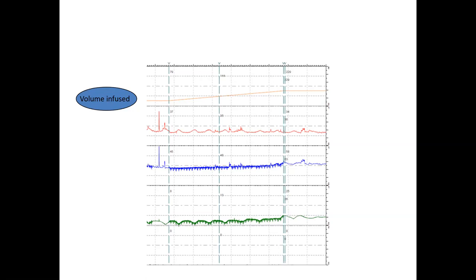If you were monitoring changes in your resting pressure here, you would also notice that you'd had a steady rise on your vesicle line as you fill. So that was a really interesting question earlier about why don't we fill at 100 mils a minute. One of the reasons, maybe in a neurogenic patient, is that sometimes the higher filling rate can demonstrate a change in compliance, which isn't there. If you've got concerns it's an artifactual change in compliance, you stop filling for 2 minutes and you wait and see if it comes back down to your resting pressure.